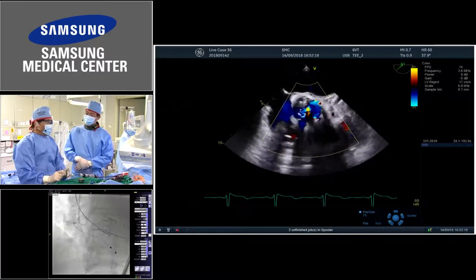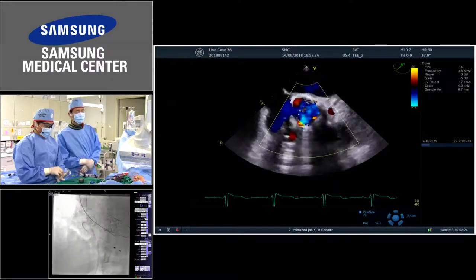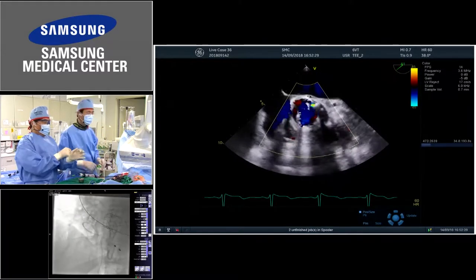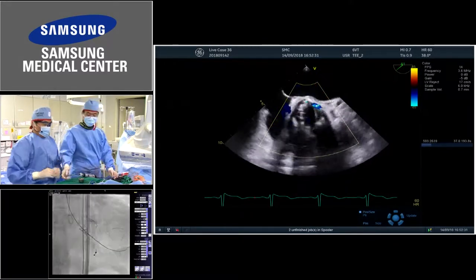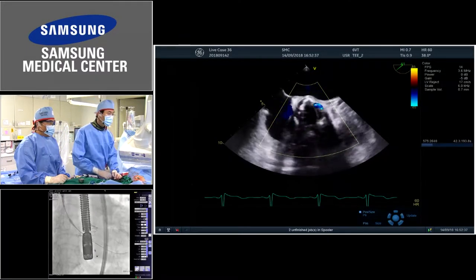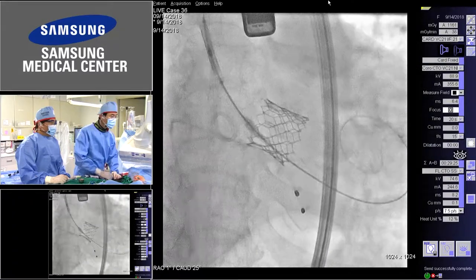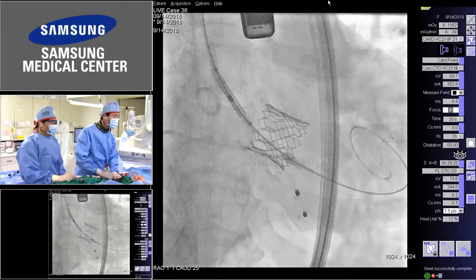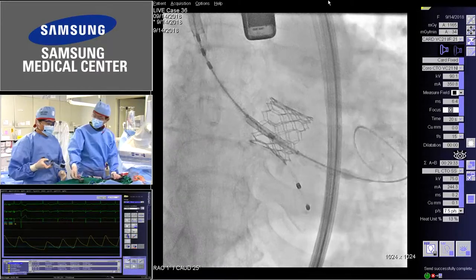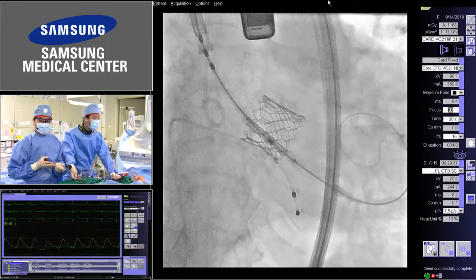Come on. 160. Yeah, 160. I'd like to do the balloon again, just nominal. This is a bicuspid valve. But as you know, with the Sapien valve, the valve is inside the stent frame, so I think the circular morphology is more important than with CoreValve. It's just 1 mil over 1 mil. It's just a nominal size. Okay? Be careful.